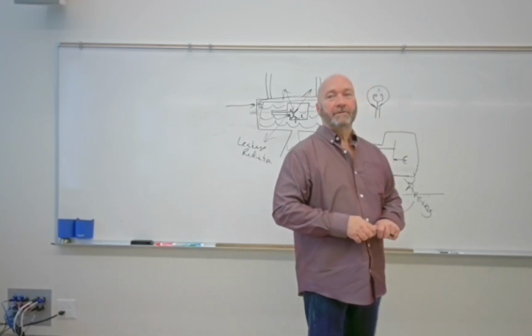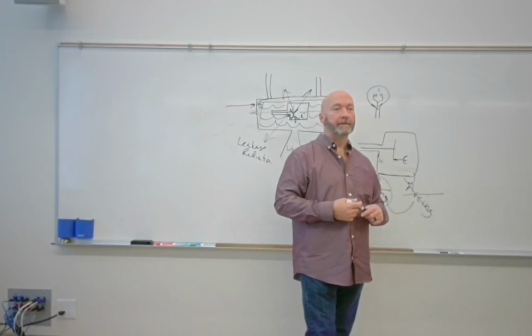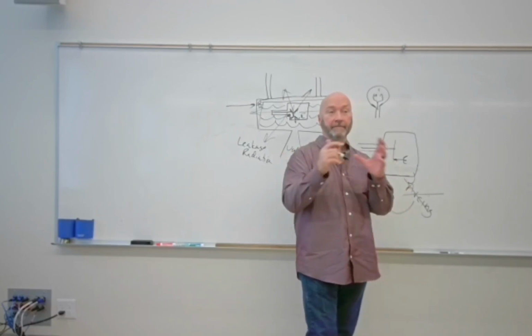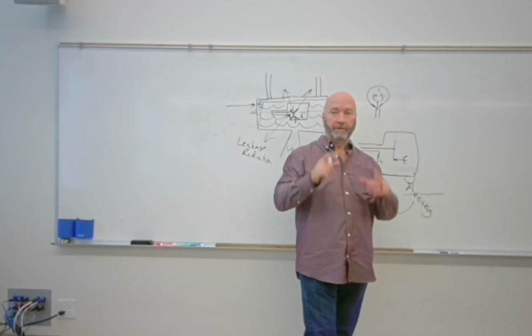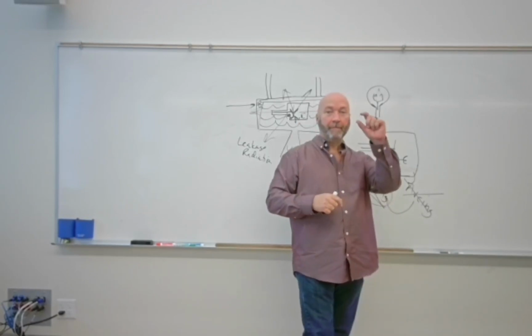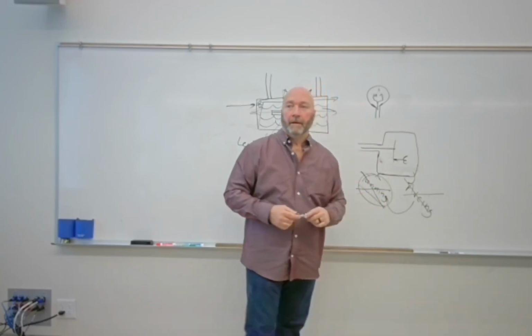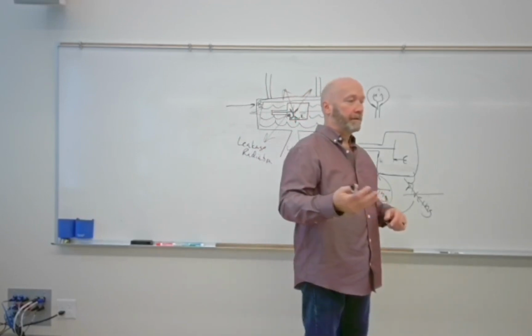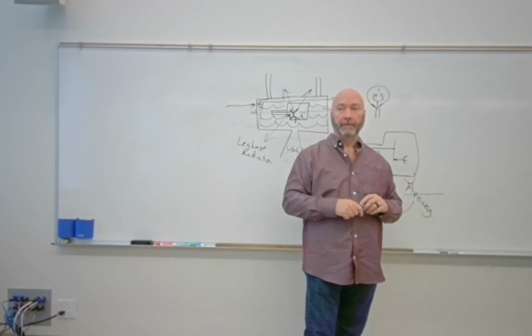Okay. Sometimes, like your portables, most of the time your portables are just going to have one filament, but some of your okay, so this is getting into the internal components. With cathode, you have two filaments. So as it's coming around, you should be able to look down and see you've got two filaments. One's big, and by big, I mean it's that big as opposed to small, which is much smaller, shorter. And the purpose for those is that if you're making exposure on extremity work where you want to see the detail, you use the small filament.